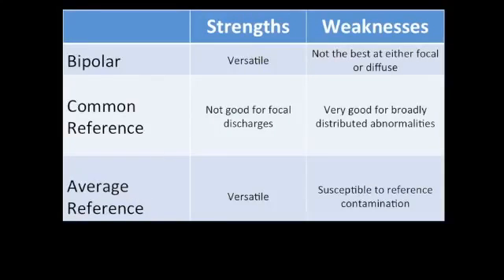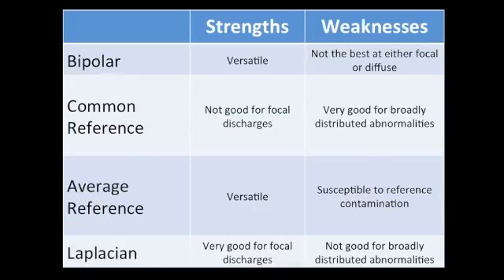The average reference montage is generally very versatile and can also be used as a screening montage. However, it is susceptible to reference contamination, as we have shown, which can lead to some misleading findings. The Laplacian montage is extremely good at looking at focal discharges, but not very good for broadly distributed abnormalities.